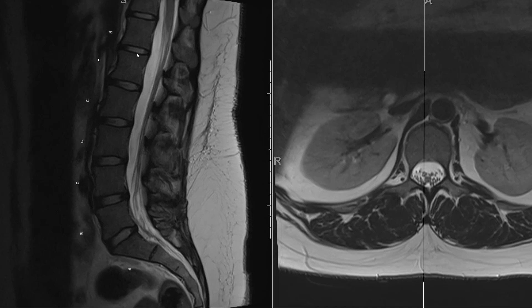We have the ligaments, which are dark on most sequences and fairly thin. Anteriorly, we have the anterior longitudinal ligament running down the vertebral bodies and connecting to the anterior aspect of the disc. Posteriorly, we have the posterior longitudinal ligament running down the length of the spine.